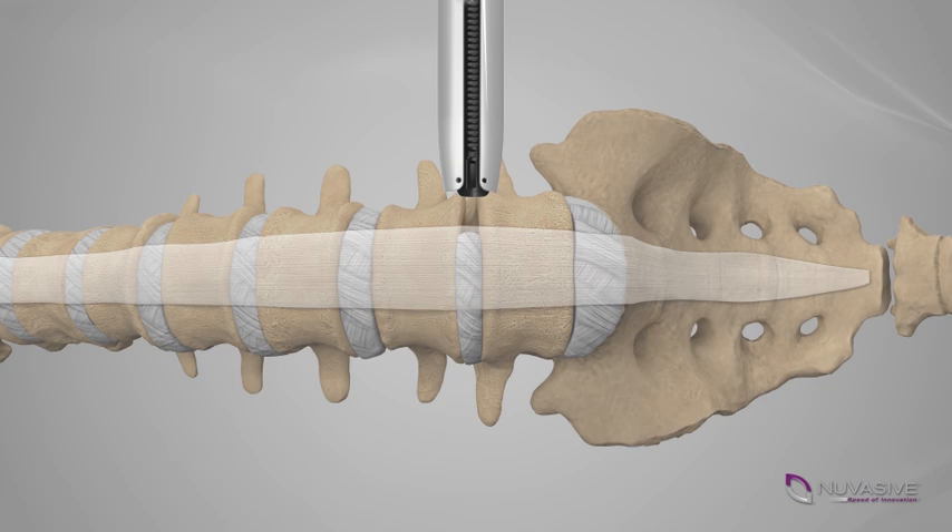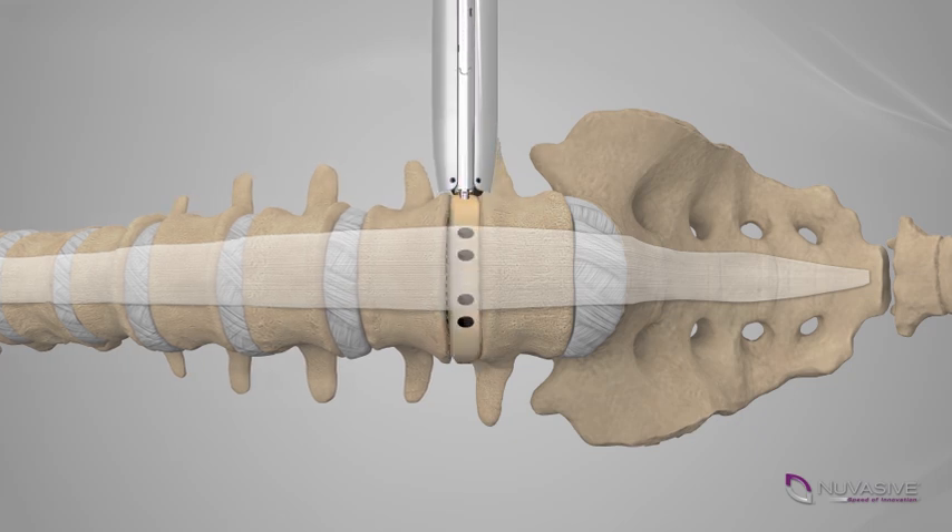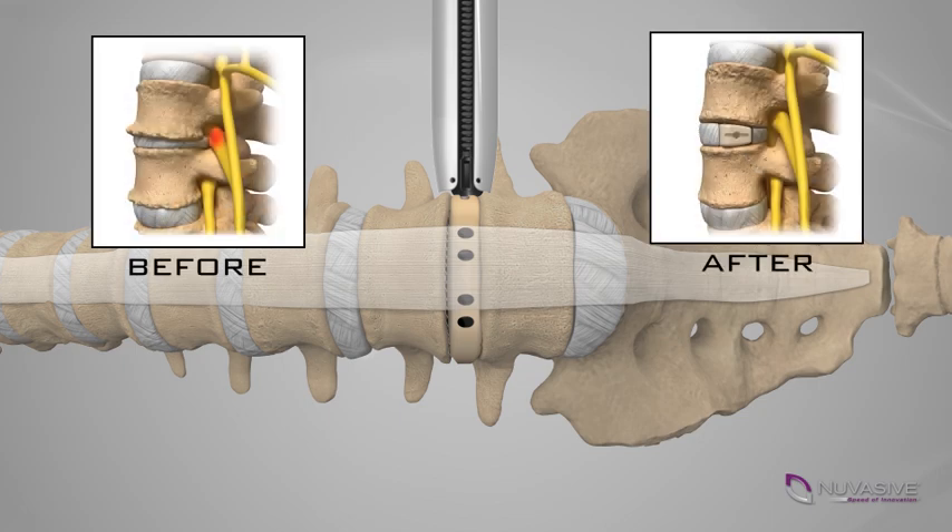The diseased or damaged disc is removed to reduce pressure from the symptomatic cord or nerve root. An appropriate implant chosen by your surgeon will be placed into the disc space to restore the proper disc height and provide mechanical support while bone grows between the vertebral bodies during the fusion or bone healing process. That segment of your spine will eventually stabilize once fusion occurs.